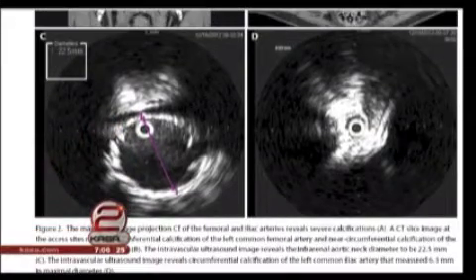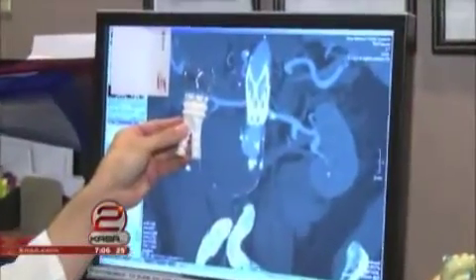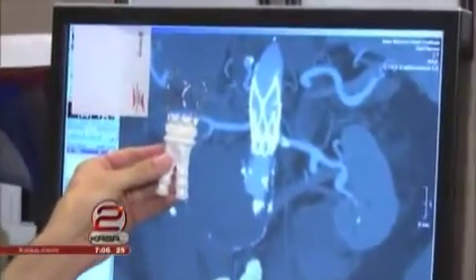That has now changed. Without incisions, big abdominal incisions, leg incisions, this is something that, again, we've done completely minimally invasively. Patients are able to literally walk out of the hospital, in most cases, in 24 to 48 hours. The device is called a Trivascular Ovation Prime stent, which features an O-ring that acts as a perfect seal once in place in the artery.